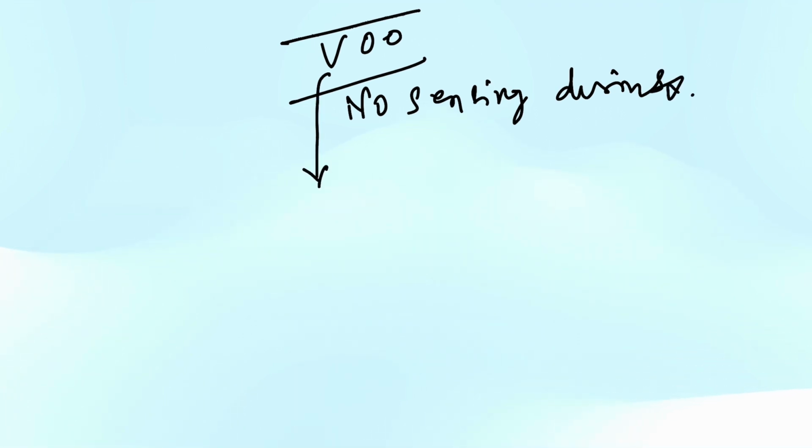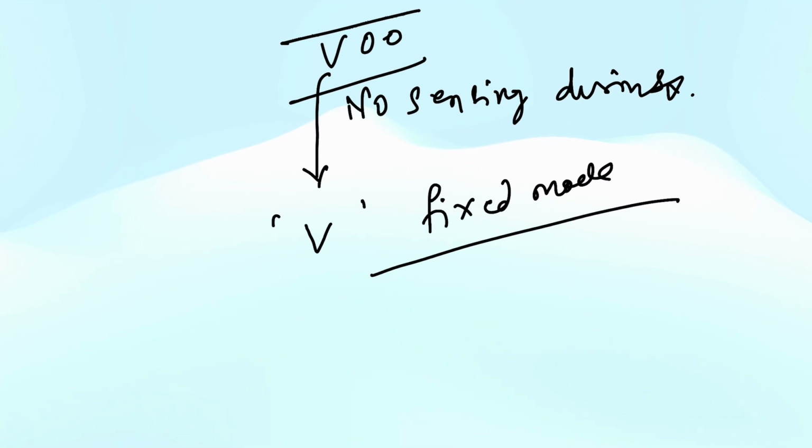In this mode, the ventricle will be paced at a fixed rate. We do not need any sensing function, to avoid interference with the cautery system or other electrical circuits involved in the procedure. So intraoperatively we need VOO mode, where the ventricle is only paced at a fixed rate.